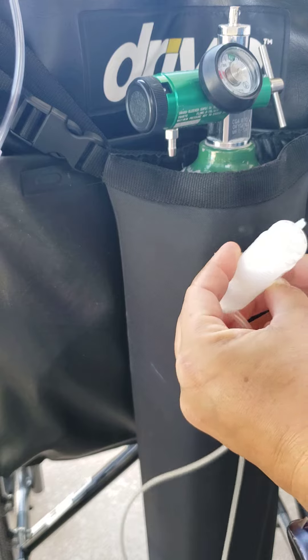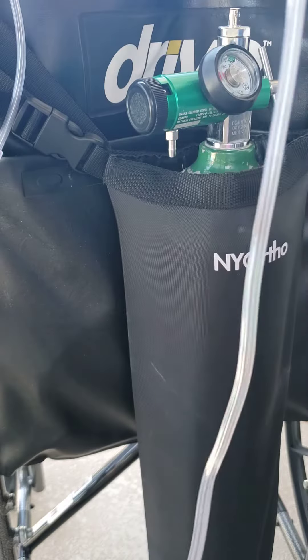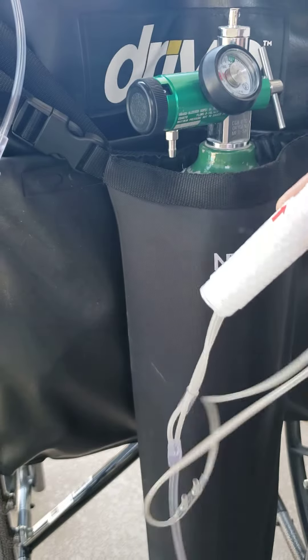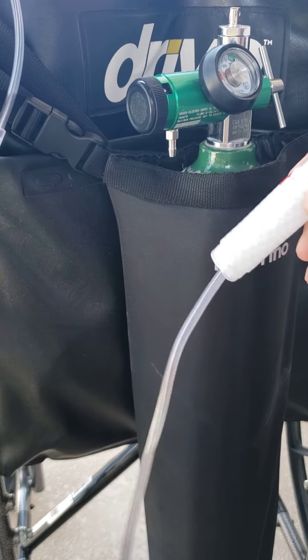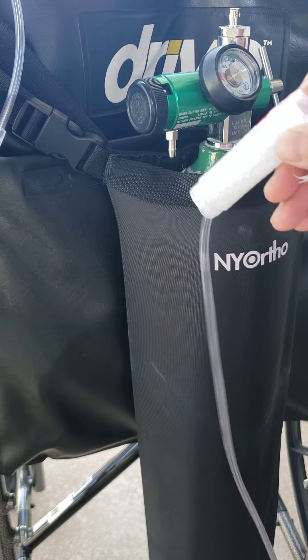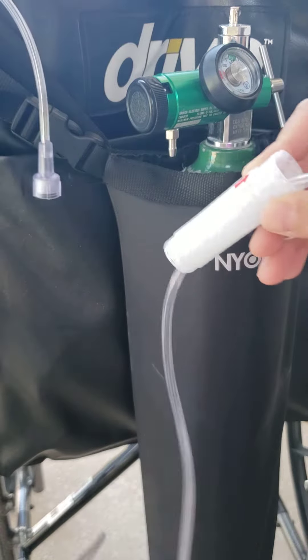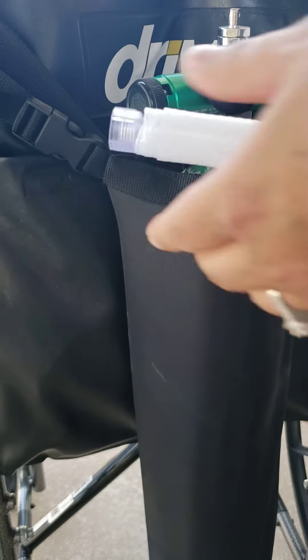So you're threading it here, pull it out, and now I'm just gonna be threading it through this 50-foot line. I pre-untangled my husband's line because otherwise we'd be here forever. But we're just gonna thread it through all the way until we get to this end here.